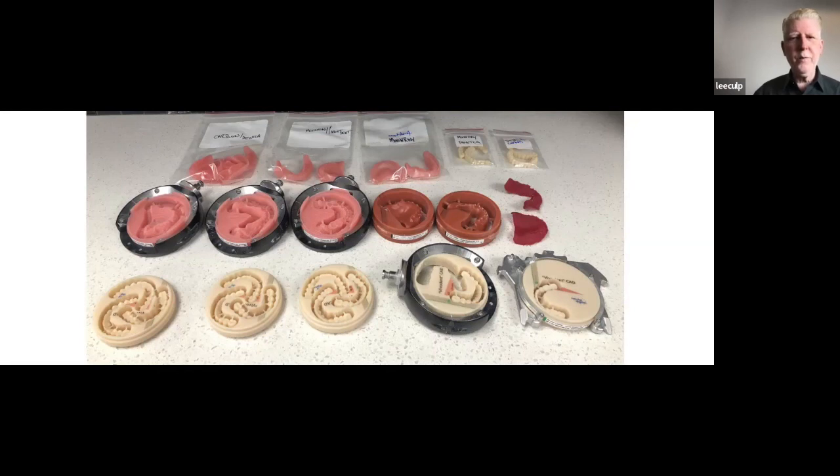And you're looking at that going, so, and the really red ones are wax. So we could actually still mill wax and still process if you want to. Like if you definitely want to process denture with teeth in it, we can mill the wax and we can still process it conventionally with Ivacap or whatever other way.